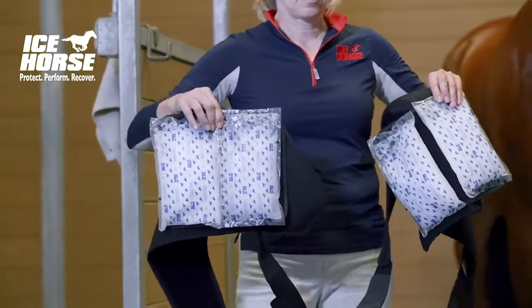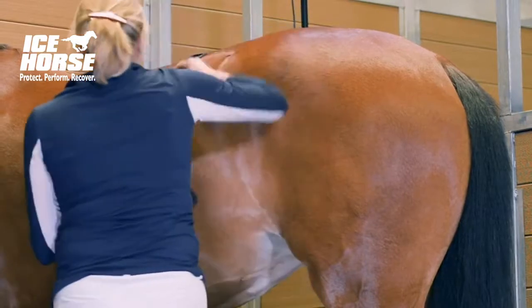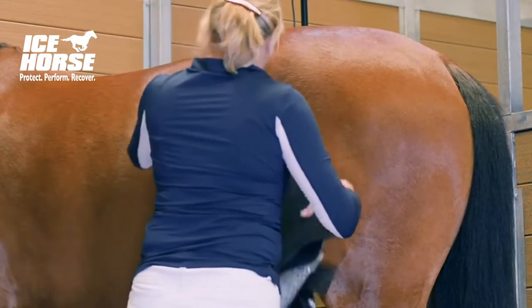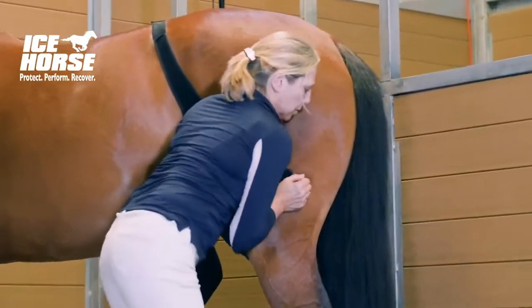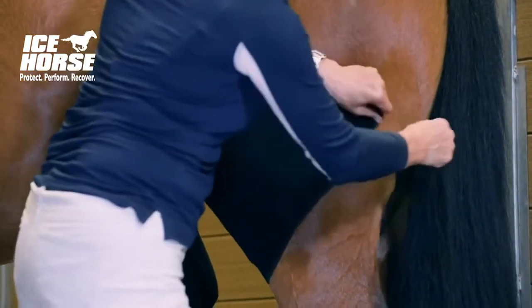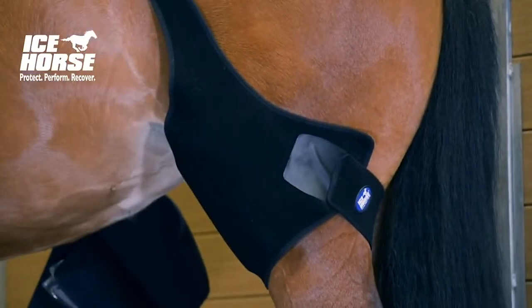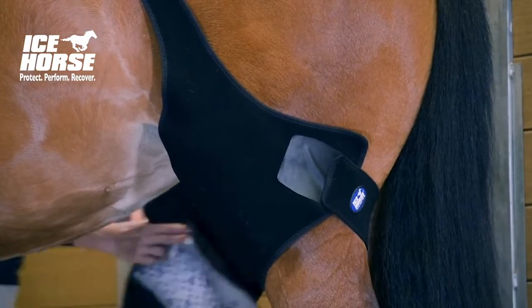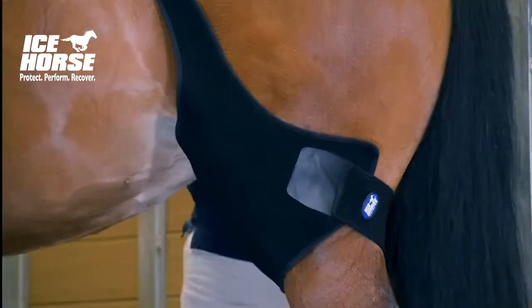Now you're ready to apply the wrap to the horse's stifle joint. Place the suspender strap over the horse's back right in front of the croup, and then starting on the left side place the ice packs right up against the stifle joint. Pull the wrap around the inside of the horse's leg and then fasten on the outside. Pull the wrap as tightly as you can to get a secure fit.